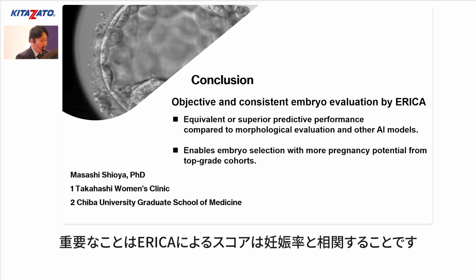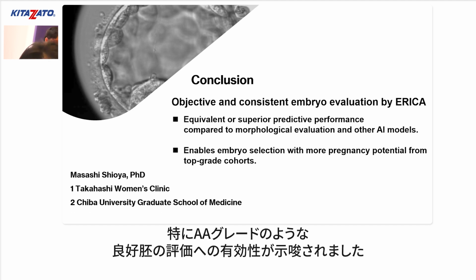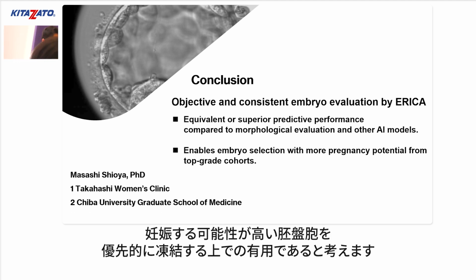Of course, a high pregnancy rate can be expected with top-grade blastocysts, but even if the grade is AA, some of the embryos do not become pregnant. I believe that we need to try to reduce the number of embryo transfer cycles and minimize the burden on the patient.